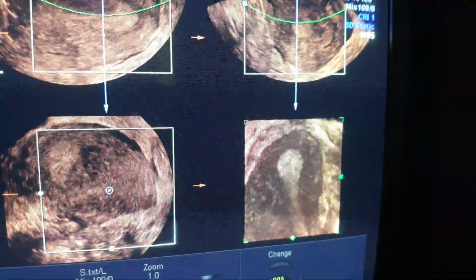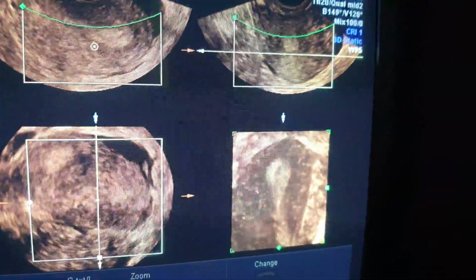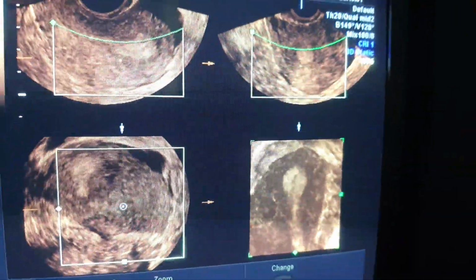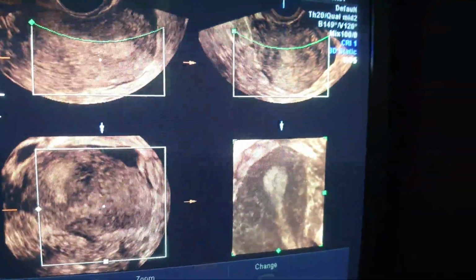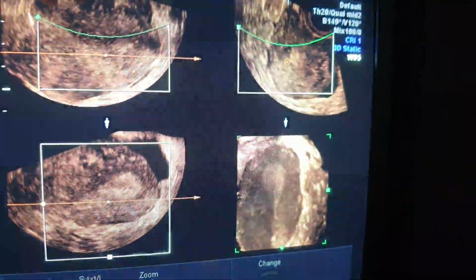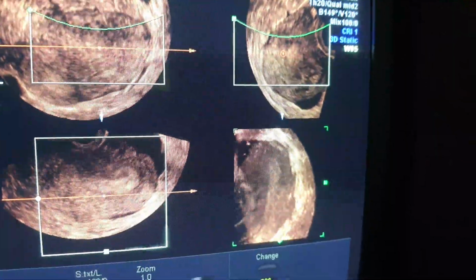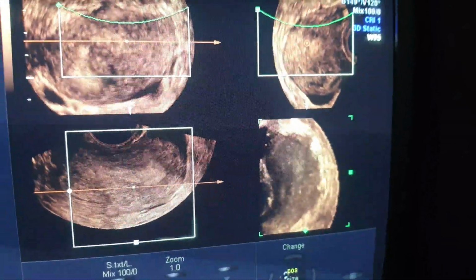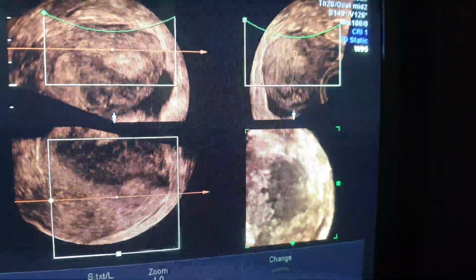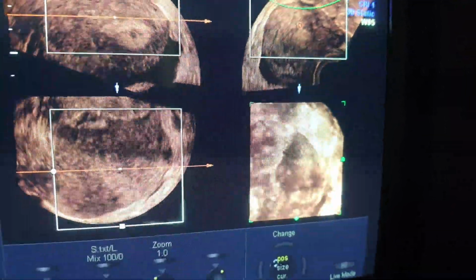You notice the movements of these buttons in which I want to reach a specific picture. And while I'm rotating this picture and working on that, please concentrate on the upper left picture here. You notice how I'm moving it and changing it, and this is very important because you are analyzing actually the whole picture at the same time, okay?